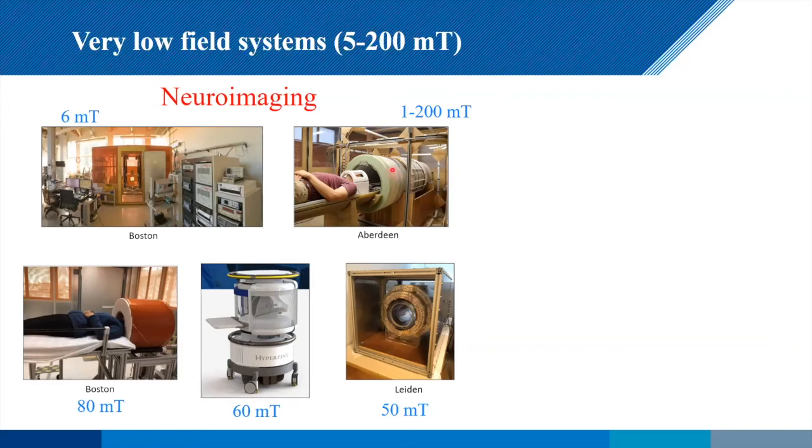This fascinating system David Lurie's constructed in Aberdeen, which is this field cycling. So it jumps from anything from 50 microtesla up to 200 millitesla. So you can really choose your image contrast that you want to look at. Of course, you've got Hyperfine over here with about a 60 millitesla system. Again, some different magnet design. And then our own one over here in Leiden, which I'll talk a little bit more about, built by Tom O'Reilly at 50 millitesla. And so one question that comes up here, actually, if you look at this, is why is it that every single low field site is within 5 kilometers of the sea? I'll see if anybody has an idea of that in the question and answers afterwards.